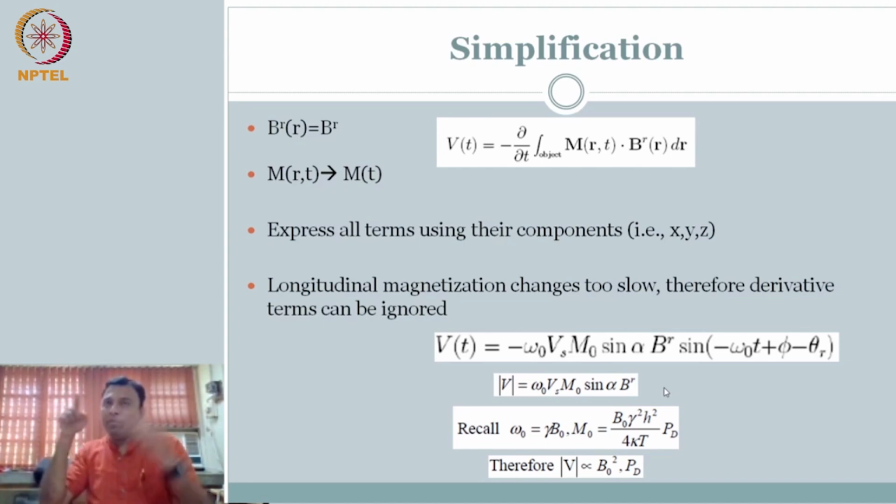We talked about applying another rotating magnetic field with the same frequency, then you can manipulate this magnetization vector. So now you get that insight. Now we can manipulate the transverse component. So we need to add one more rotating magnetic field to manipulate this alpha. Then we could get signal. So we need to build our material to add to our signal equation, the motion equation. What happens? We add an additional rotating magnetic field.